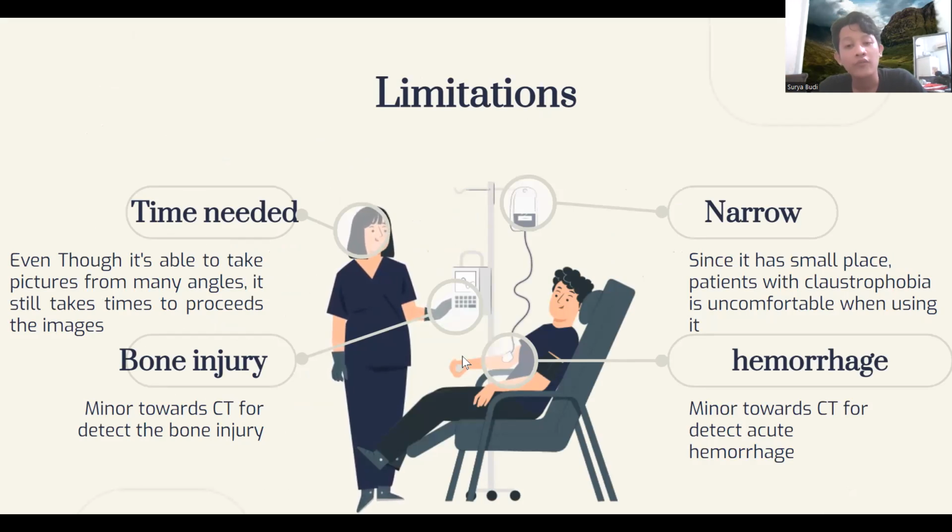Even though MRI has a lot of advantages, there are also some limitations when using MRI. The first one is that it is time consuming. Even though it is able to take many pictures from different angles, it still takes time to process those images into the computer model to be seen by the physician to be examined.